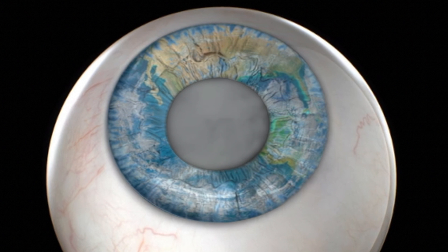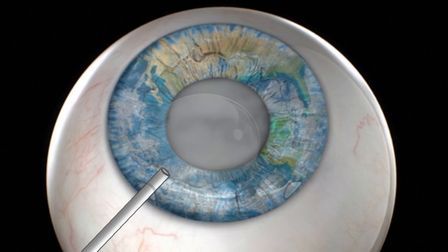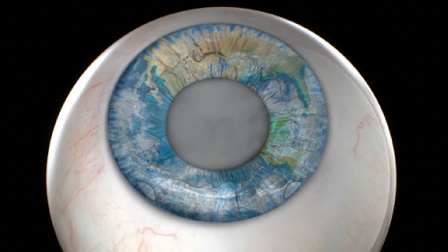After the eye is dilated, two or more incisions are made in the cornea periphery. Medication is injected into the eye to prepare the lens for surgical removal. A circular incision is made to the lining, or capsular bag, enclosing the lens and removed.